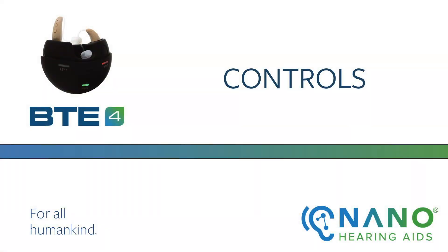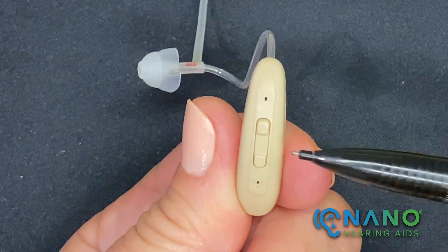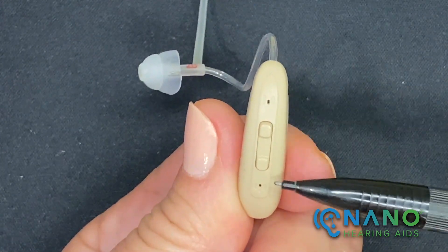Welcome to the Nano BTE-4 tutorial on the controls. The controls on the BTE can be used to turn the hearing aid on and off, change the volume, and change programs. We'll be reviewing the programs in a bit. There are two controls on the hearing aid: the upper button and the lower button.